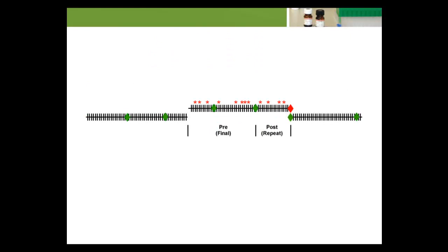This illustration shows an analytical process where the number of unreliable results generated prior to the last good QC is about twice as large as the number of unreliable results generated after the last good QC. The vertical strokes represent patient specimens being examined.